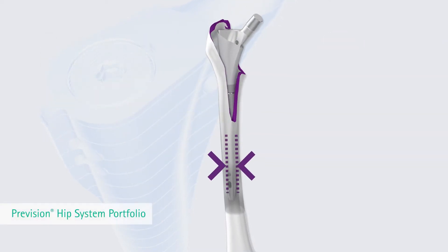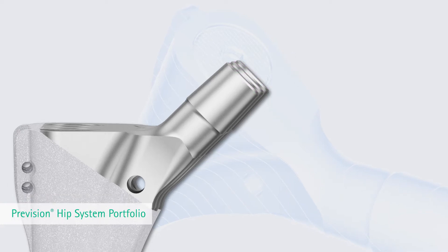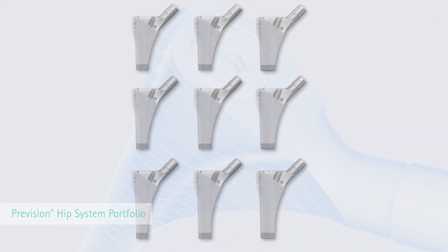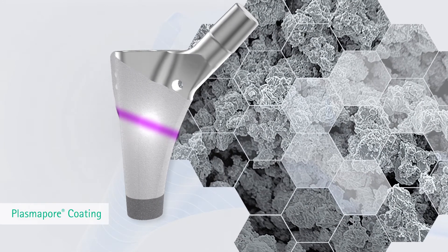To gain essential secondary proximal load transfer through bone regeneration by fracture healing, three proximal body sizes with increased offset and three different lengths — 0, plus 10, and plus 20 millimeters — to adapt different defect zones are available. All proximal components are coated with plasmapore to assist osseointegration on the proximal component surface.